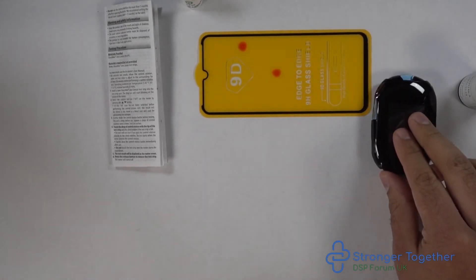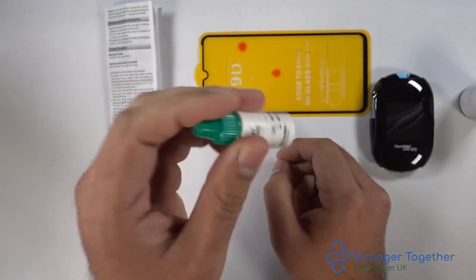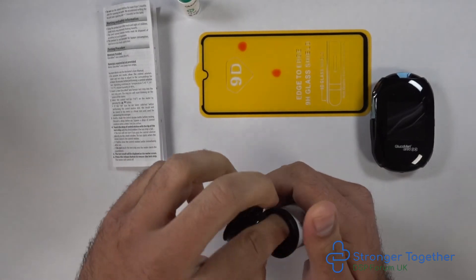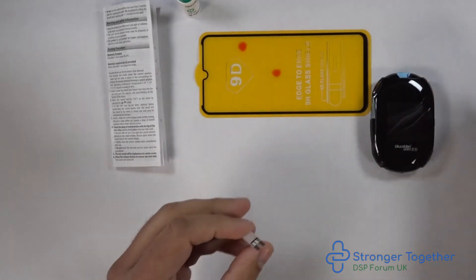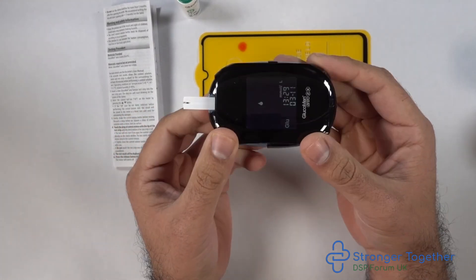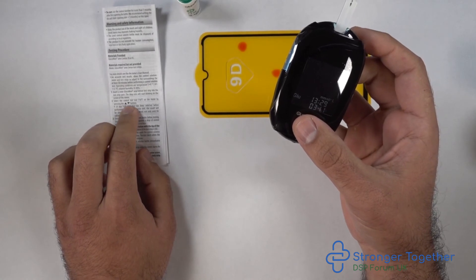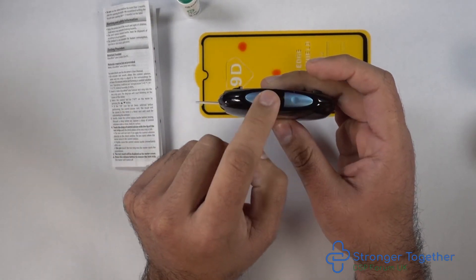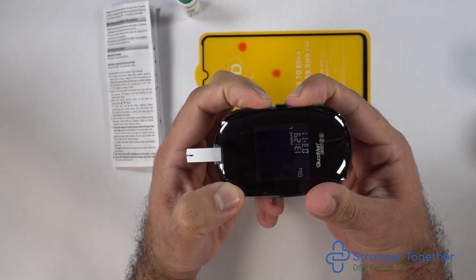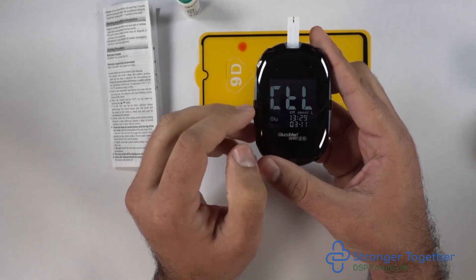Let's now see this with the Aereo 2K machine — we use precisely the same procedure. Shake the bottle, then insert our test strip into the machine. We can see the drop flashing on the screen. Press the two buttons on the right-hand side down simultaneously. The letters CTL will appear indicating we are ready for a control test.